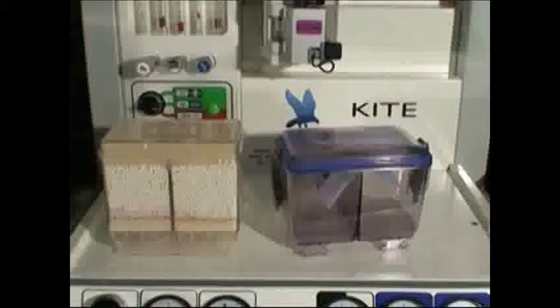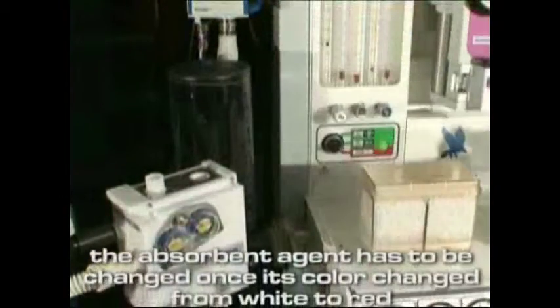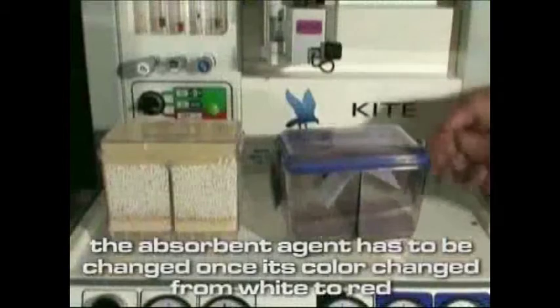Carbon dioxide absorber. An important part of a half-closed or fully closed patient breathing system is the carbon dioxide absorber with its absorbent agent, soda lime. Actually, two types of absorbers are in use, disposable and reusable types. The advantage of reusable containers is clearly the reduction of operating costs. The absorbent agent has to be changed once its color changes from white to red.